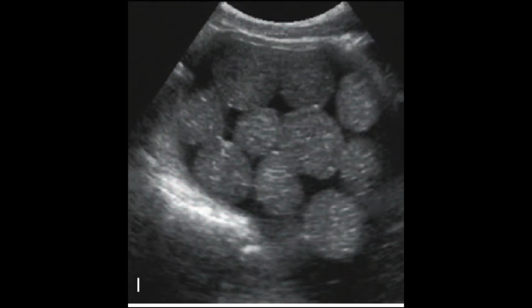So correlate your transabdominal finding with the transvaginal finding, and if the patient says she feels some mass within the pelvic region, palpate the area, and on the exact position, perpendicular to that lesion, put your probe on, so you will definitely see something wrong, and that would be your real diagnosis.